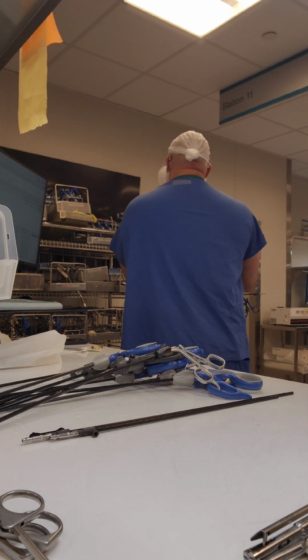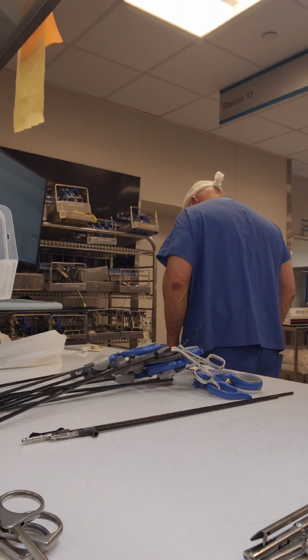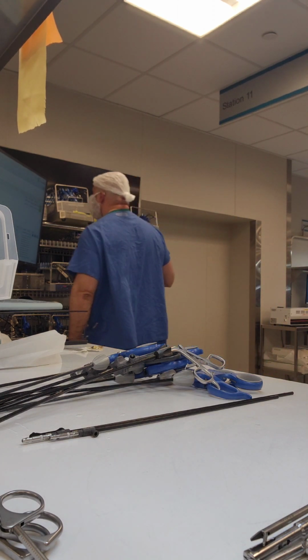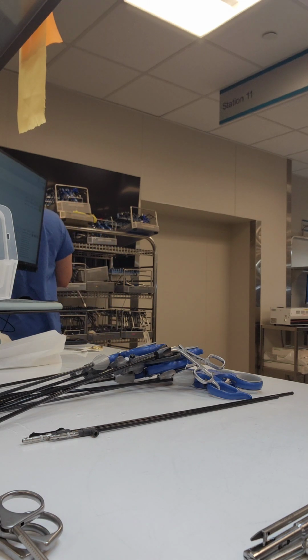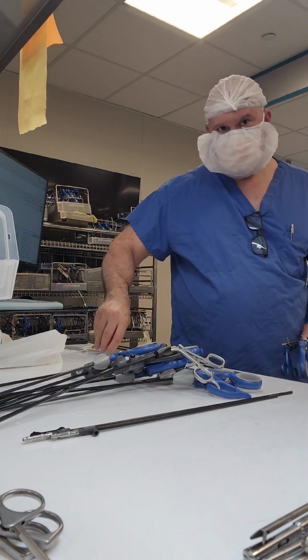So I wind up pausing it, and I was looking for the basket where the instruments were at, and I remembered that instrument basket is actually along the back wall, because this is where I got this rack from. I was like, oh man, I didn't grab the surplus instruments. So even though I'm still looking there, again, wasted movements, guys. This is wasted time here. Now it's not long, but it's wasted movements.